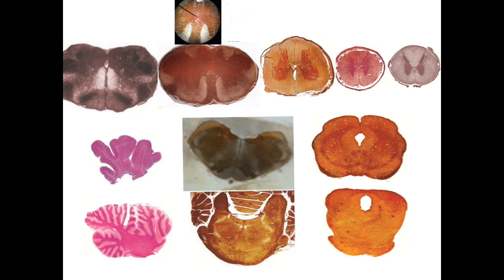Then no central canal. And what is the meaning of central canal? It is a small canal. Here I have a big canal which is not in the center. It is big and deviated posteriorly. So this is a midbrain. No canals at all.